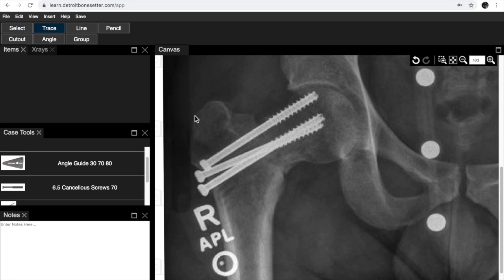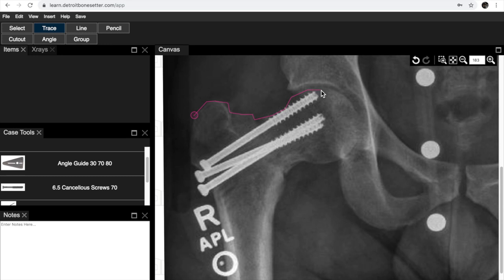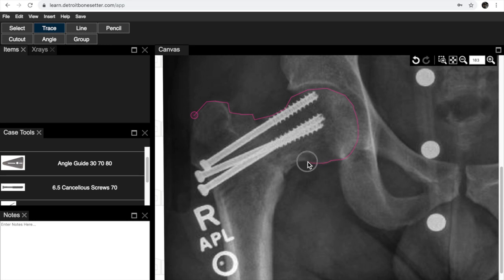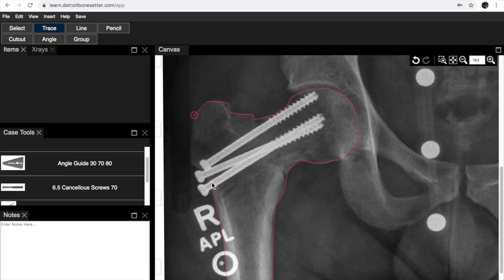Now we're going to do a trace and we can trace out the fracture here. It's just by clicking on little points or you can do a drag with your pencil like this. Then what you want to do is you want to come back to where you started and it'll make a trace of the bone that we're working with.